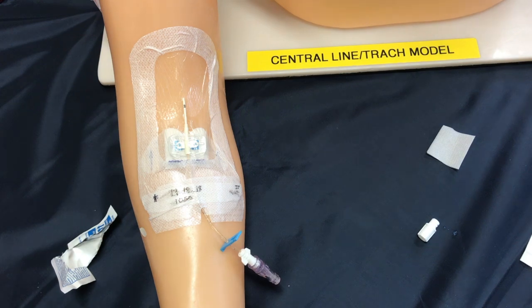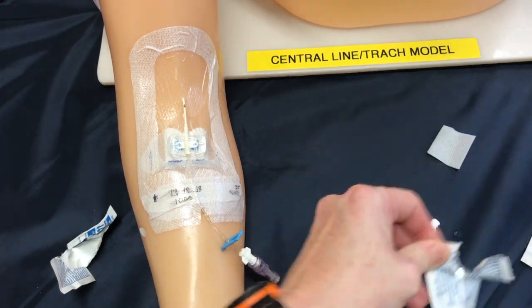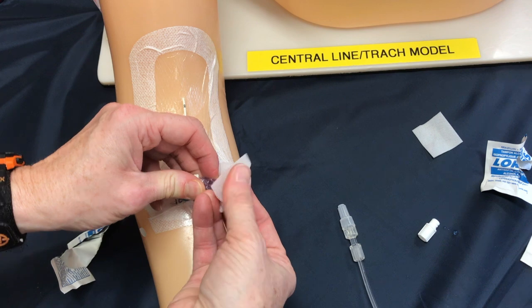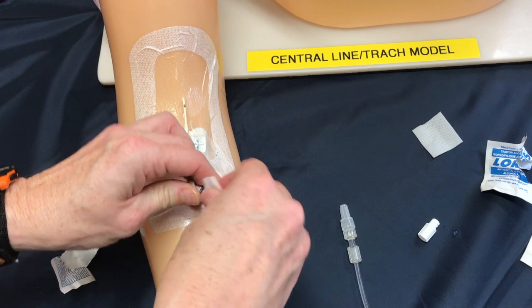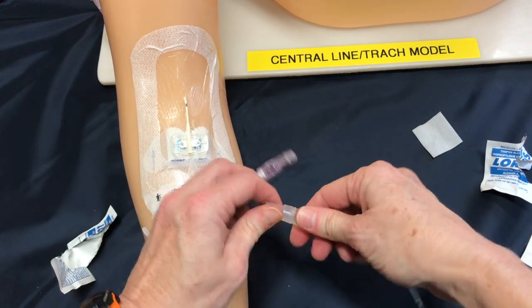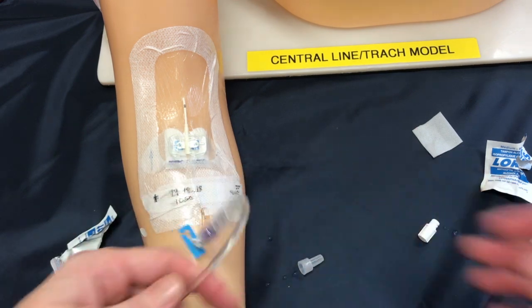Now that I've disconnected my saline, I need to cleanse the port again before I can attach my medication. So again, a 15-second scrub using an alcohol swab or a chlorhexidine swab, using friction to help remove any microbials or bacteria that are on the cap. We let this air dry and prepare to secure our medication or infusion line into the neutral cap with a pushing and twisting motion, and now we're ready to start our infusion.